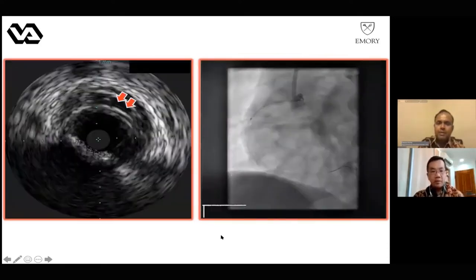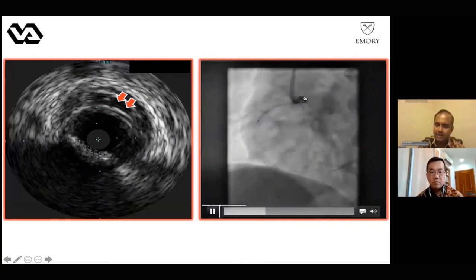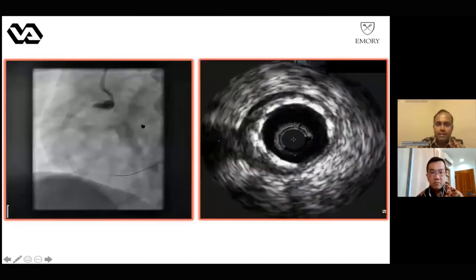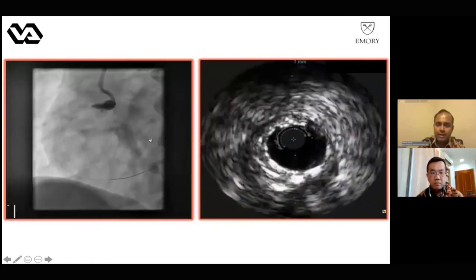That's my opinion. Yes. So we identified this, and just like the panel said, we decided to put a new stent that covered it all the way into the aorta. Notice that we are using an Amplatz guide here. For the more junior operators, we disengage this guide to ensure that we are coming into the aorta with the stent. Very important technique, because an Amplatz will generally tend to engage deeper. And this is after deploying the stent. We then went with a flash balloon and sealed down the stent.